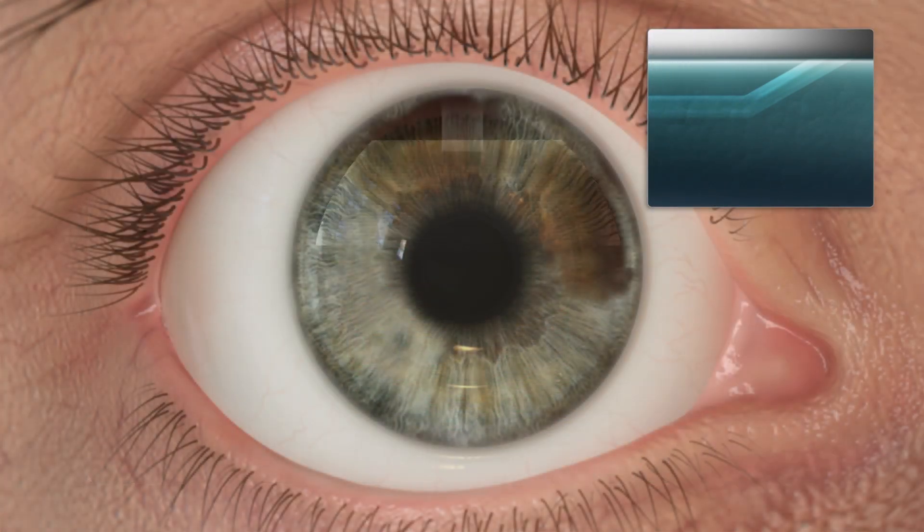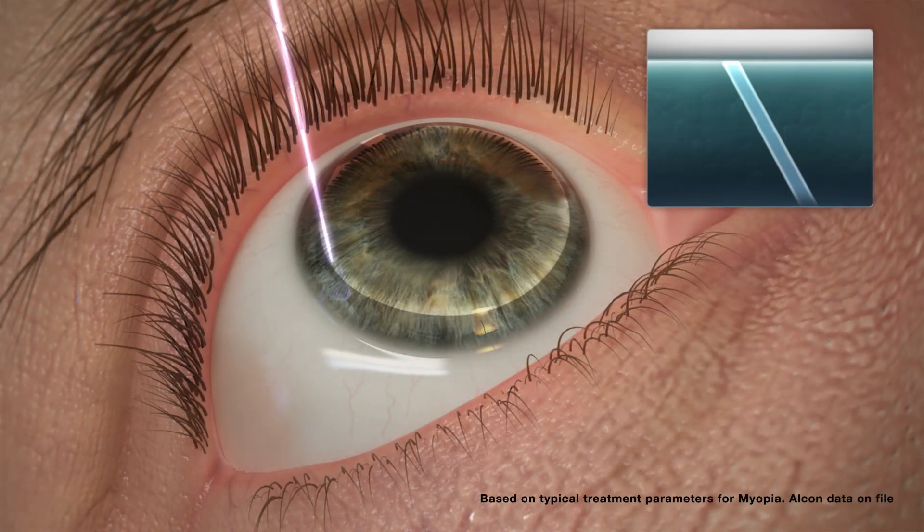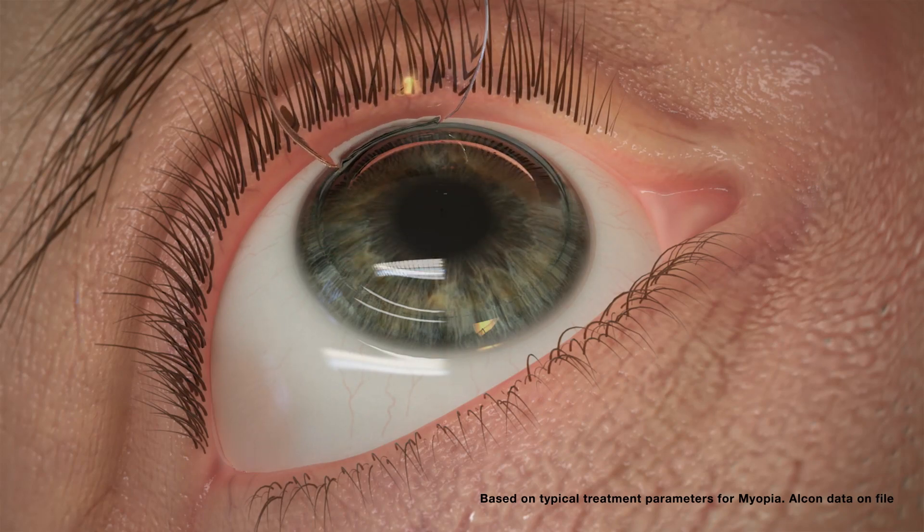Once the cleavage plane is complete, a side cut treatment is applied, allowing the Wavelight FS200 to create a standard flap in approximately six seconds.